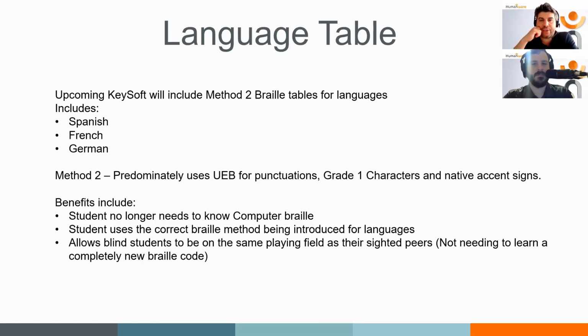Another question from Wendy. Yeah, there's different size cards. You can go with a 16 gigabyte SD card, or 32 gigabyte SD cards. There isn't a particular model that I would suggest. You can always speak with the HumanWare tech team if you are concerned about that. But generally, most SD cards will work.